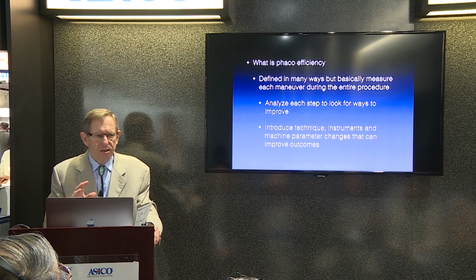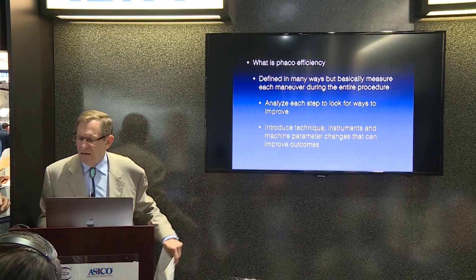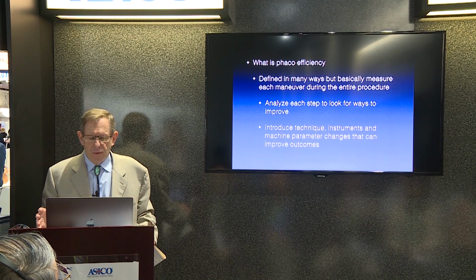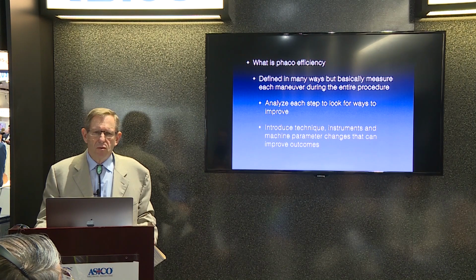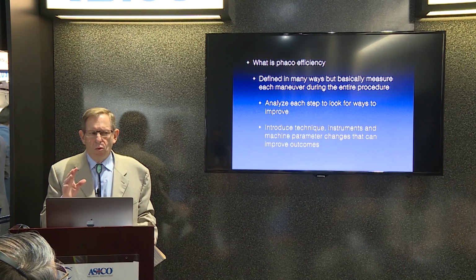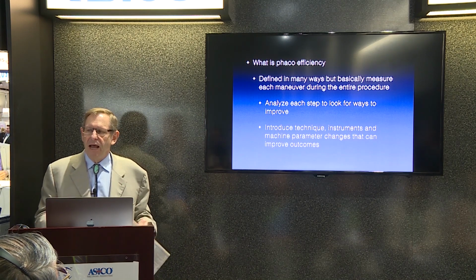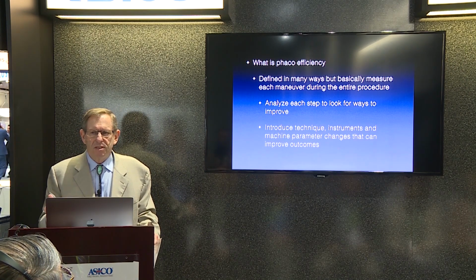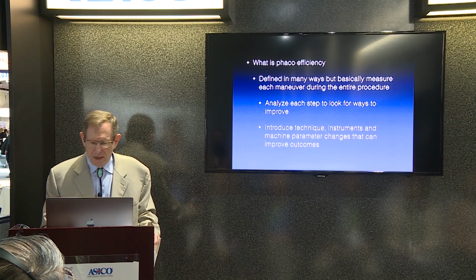It's pretty amazing if you go back and watch your videos. Often you'll get clues as to what's going on, and you'll get an idea of how to improve your surgical skills. The other thing is to introduce new techniques, instruments, and look at machine parameters that can improve the outcomes. One of the things that's pretty amazing is if you look at many surgeons, and it's not a criticism because most of us do this, but you can almost tell when they graduated from residency by how they do the cataract, divide and conquer, whatever it is. And I think we get comfortable with what we do, but there are improvements that come along, and I'm really happy that I'm lucky enough to know Taka, and his mind's always going, and it helps us introduce new things.